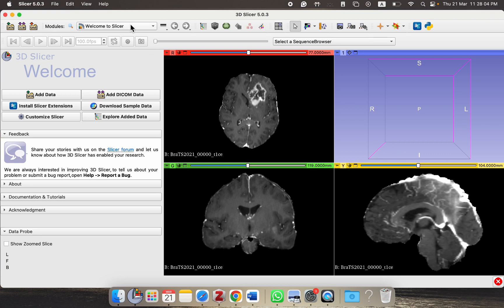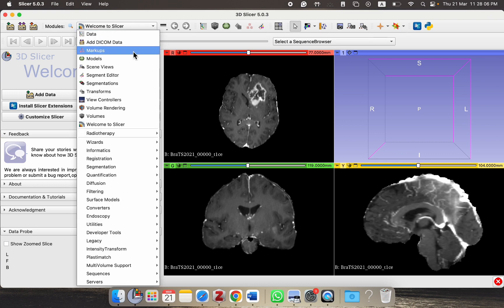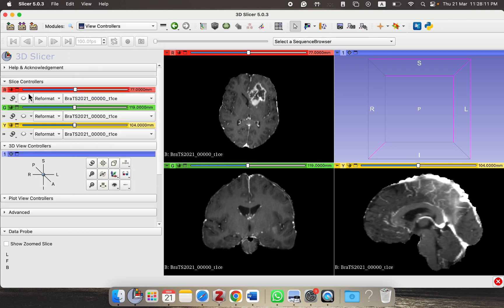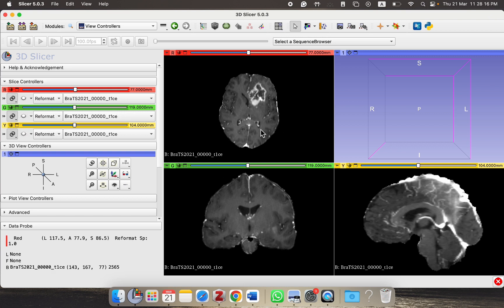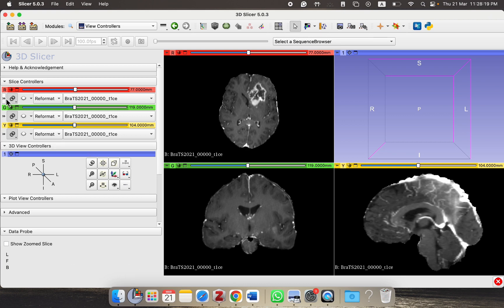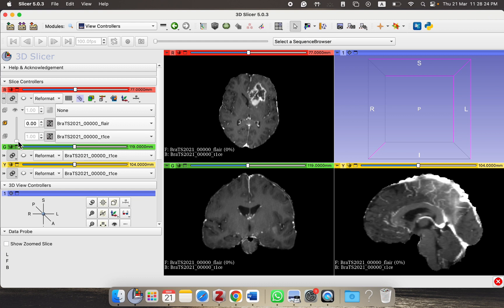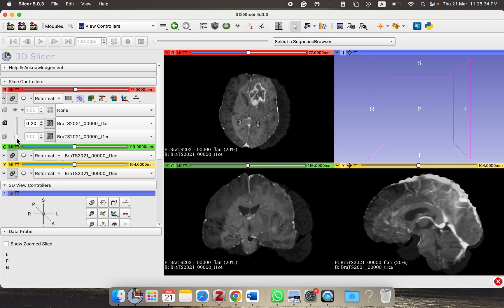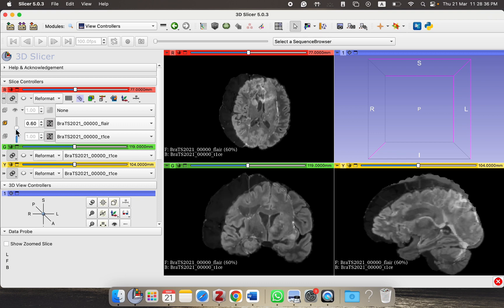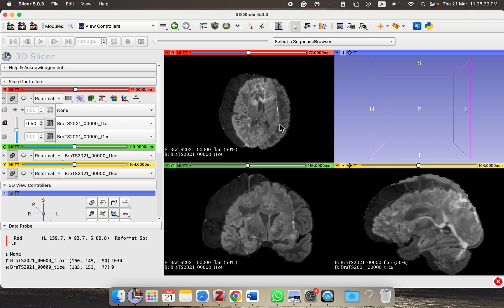First of all, we are going to see what the main issue is — what we mean by misalignment. Go to the view controller button and click the link ring to make sure that any step performed on one view is applied to all views. Click the two arrow buttons and select the FLAIR volume. Now drag the overlay tool to 50% and as you can see, these two images are not aligned.